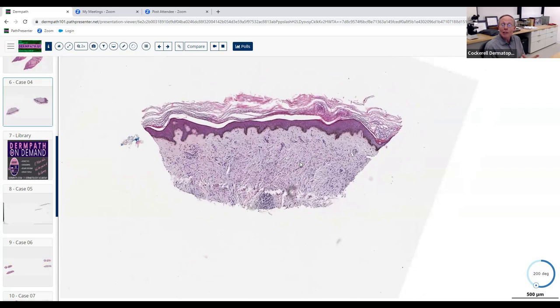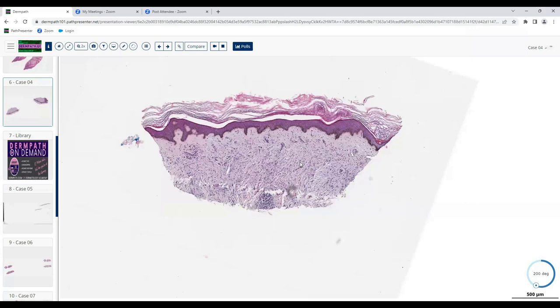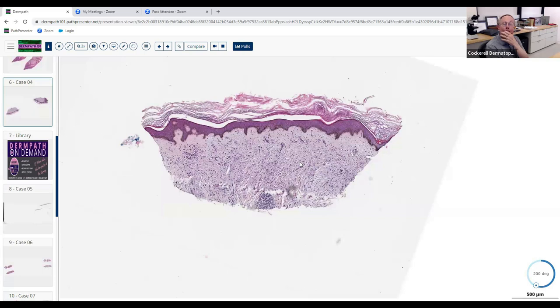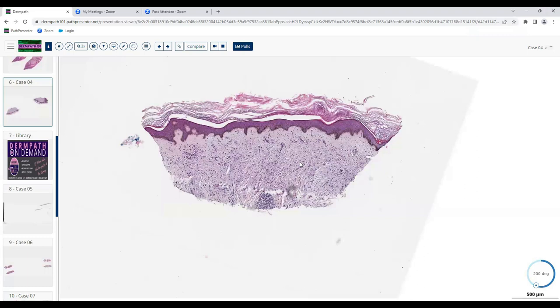There are only about half a dozen entities that give you an interstitial, mostly pattern in the dermis. For this 'busy dermis' differential: interstitial granuloma annulare is one pattern. Also scleromyxedema, blue nevus, and dermatofibroma — though dermatofibroma doesn't truly give you that interstitial pattern. Interstitial really means inflammatory or neoplastic cells splaying between collagen bundles like busy bees swarming through the dermis.